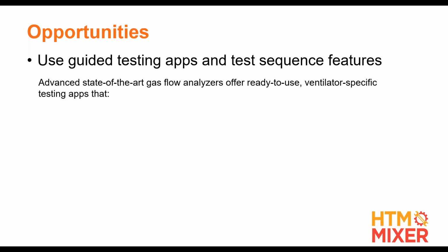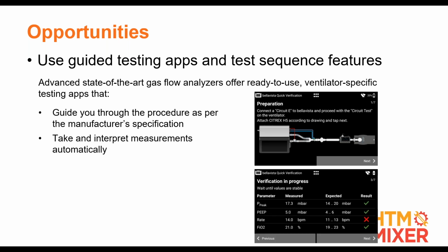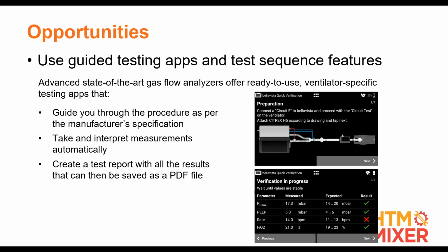Some of the new analyzers are really good. The state-of-the-art ones have ventilator-specific apps, and they actually guide you through testing. They show you graphically how to do test setups, and what ventilator settings to make. They have the pass-fail criteria built in, capture the data, give you pass-fail, and at the end create a report for you.